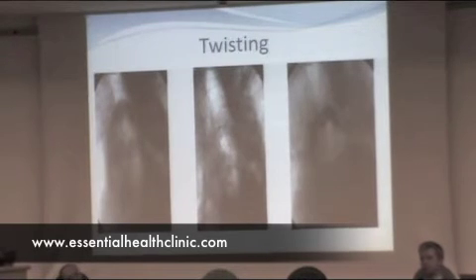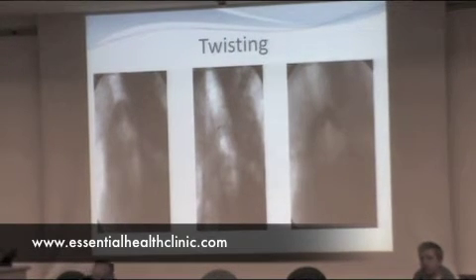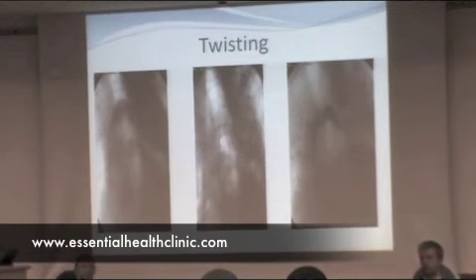Again, a similar thing, azygous narrowing here, just below the arch, very poor result after simple angioplasty, and reflux into the collaterals. And this is during stent deployment, and this is after deployment, there is no more reflux.